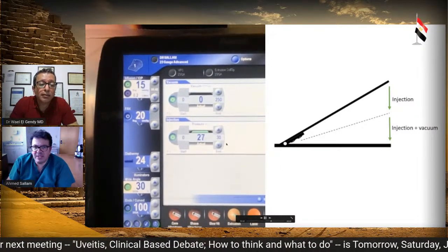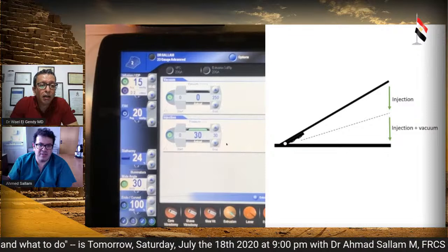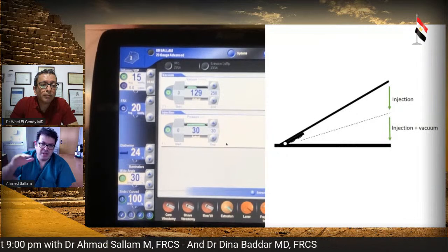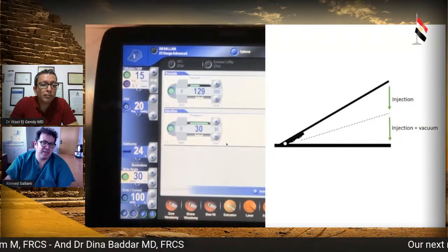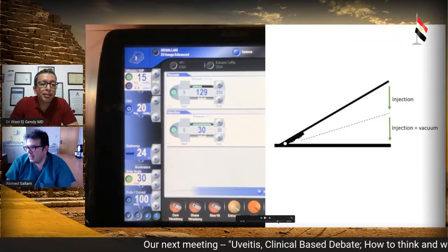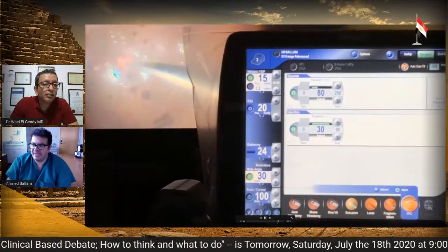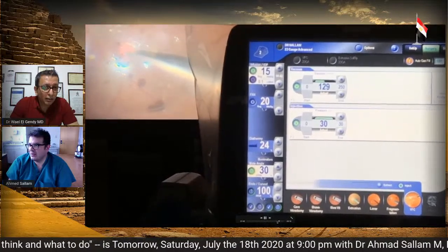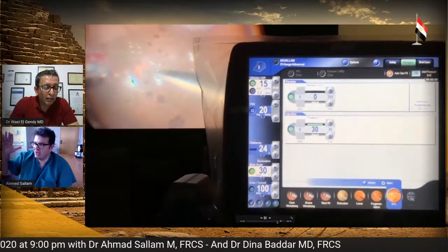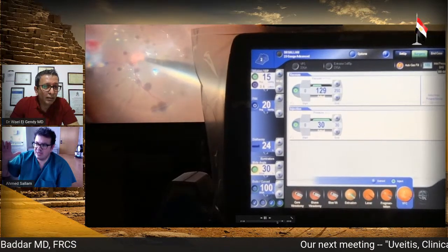So all the way down, and you'll see it again here. As it hits the 30, look at this, it hits the 30. Now the aspiration is going to kick in. And I'm pressing more. The 30 remains, but the aspiration is now kicking in. Very nice video. Now you see what happens on the machine and from outside. And you can see the disc remains pink. So now you're injecting, aspiration is kicking in, and the injection continues. And the disc is pink.